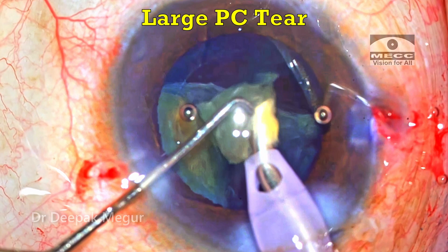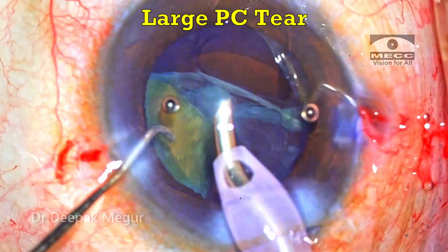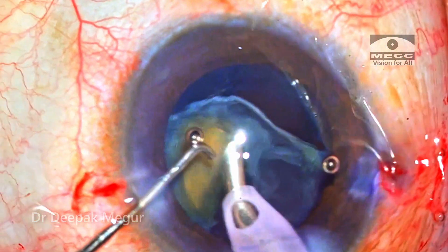A large posterior capsule tear is noted at the fag end of emulsification with two fragments still in situ. How did I manage? Let's find out.